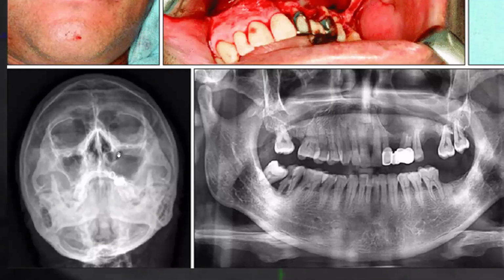So it's pushing the medial border further medially. And then this is not a normal sinus border. There's a lot of variation in sinuses, but this just dips too far down in the anterior. It's also very curved, has a very benign type of appearance to it.